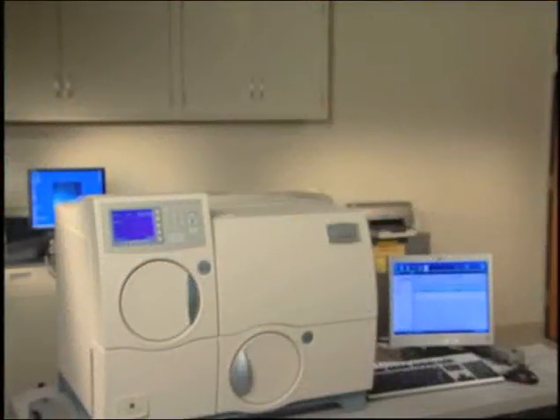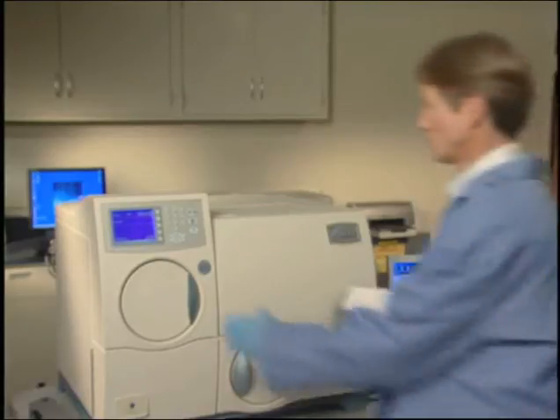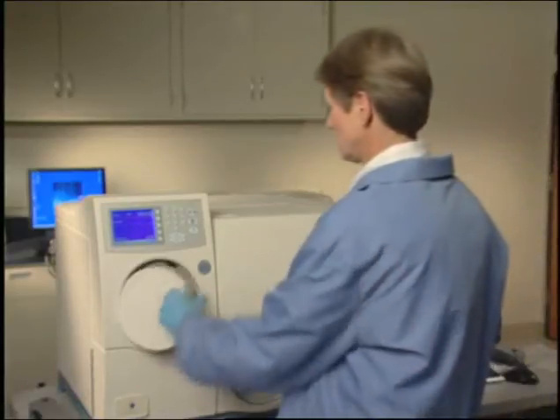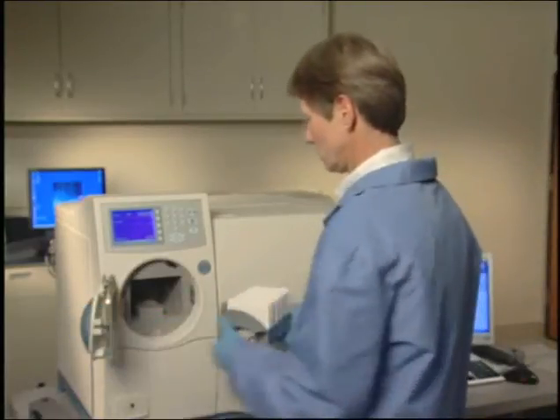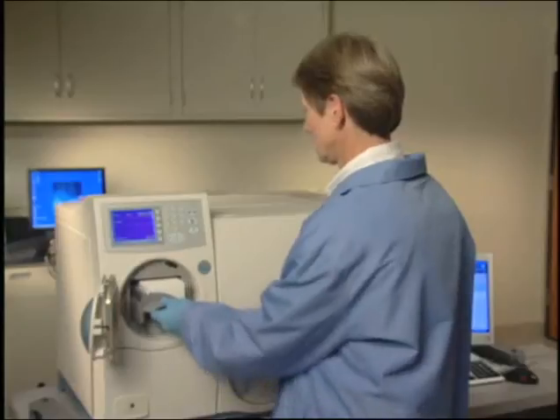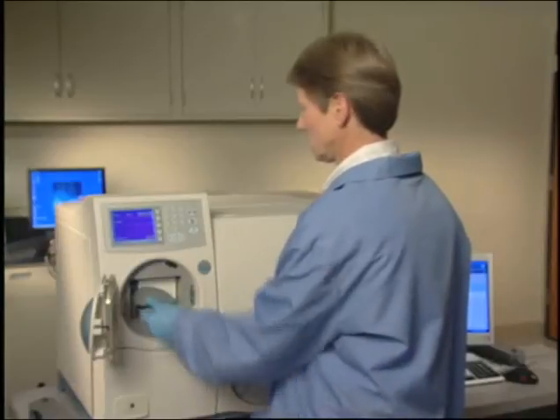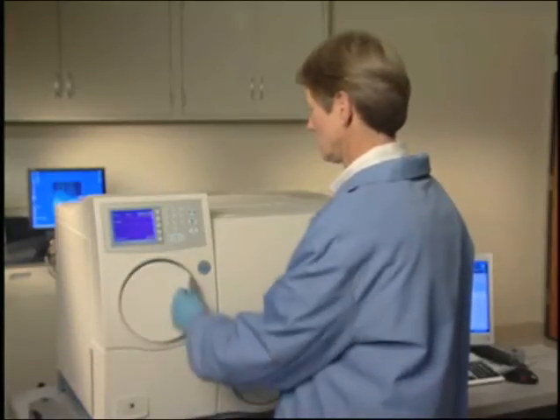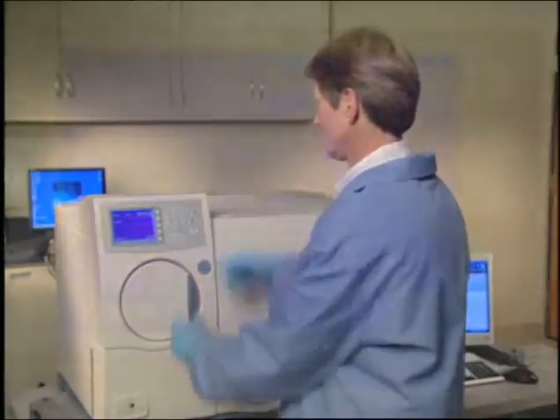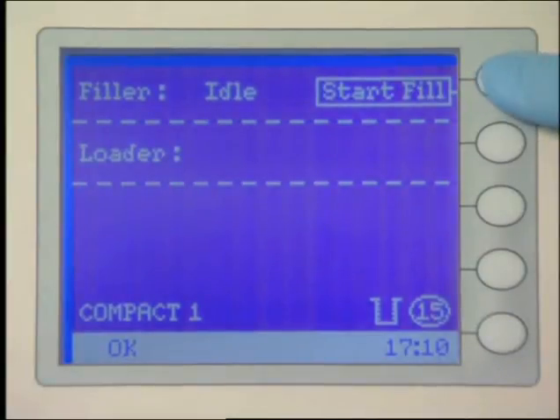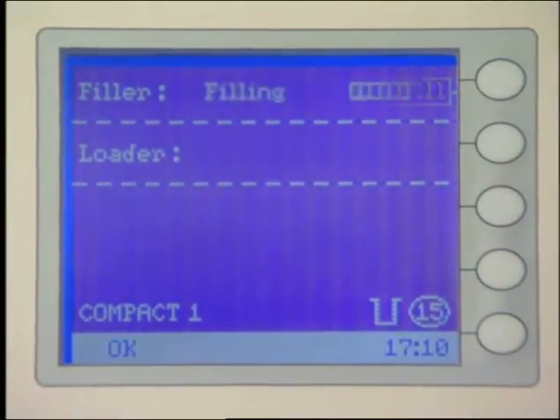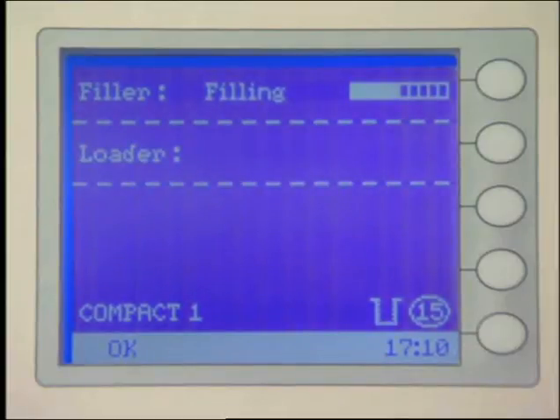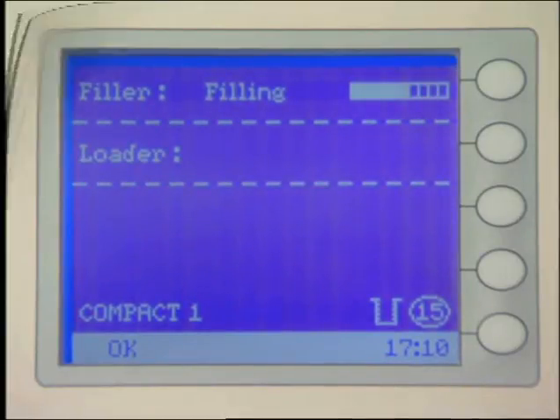Suspensions, along with the test cards, must be loaded into the Vitek II Compact instrument within 30 minutes after preparation. Place the cassette in the fill station and press Start Fill on the user interface screen.